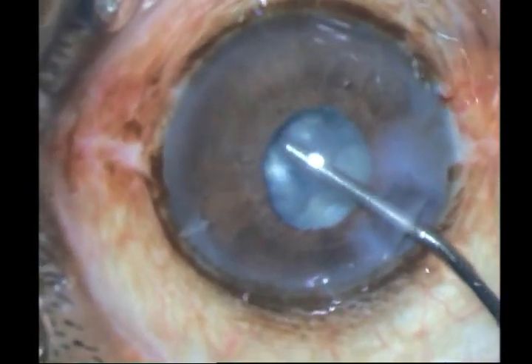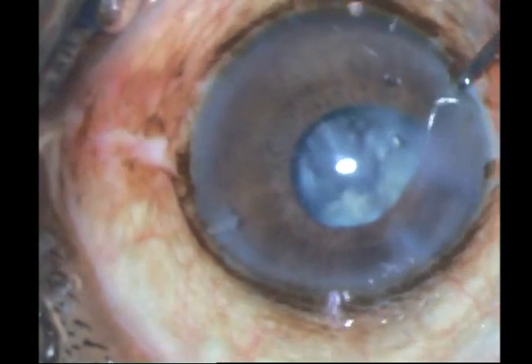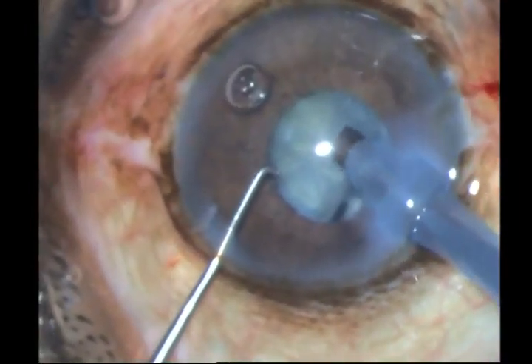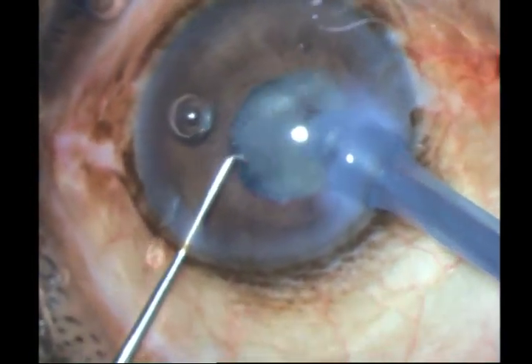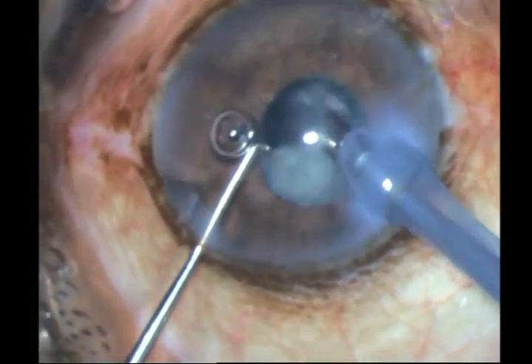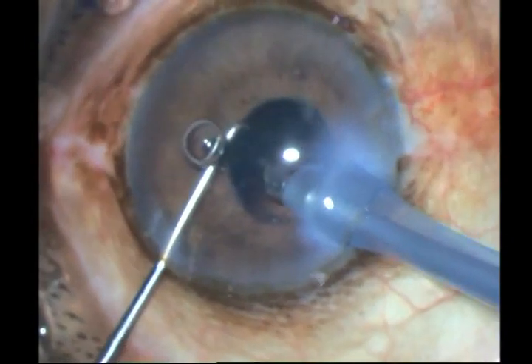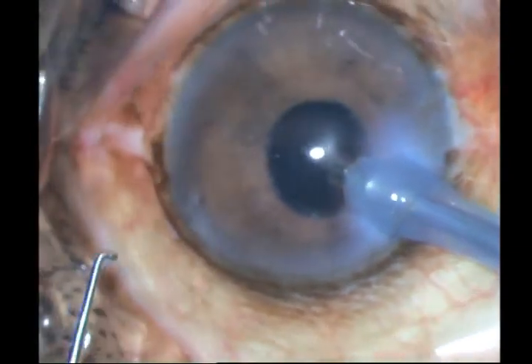I put in HPMC and rotate these fragments for better access to my phaco tip. Don't move around with your phaco tip too much in the anterior chamber because then you would catch the sphincter. And there goes one piece, and that's the final piece — do it very slowly, that's it, all out. These small bits you can just get out with your infusion itself.